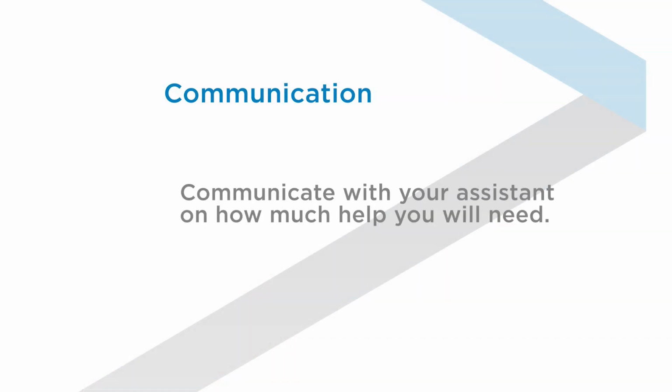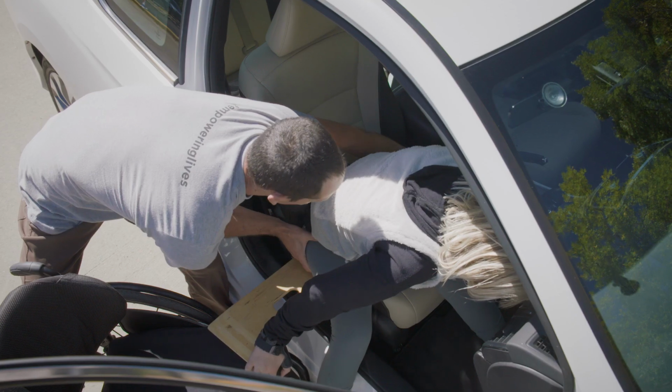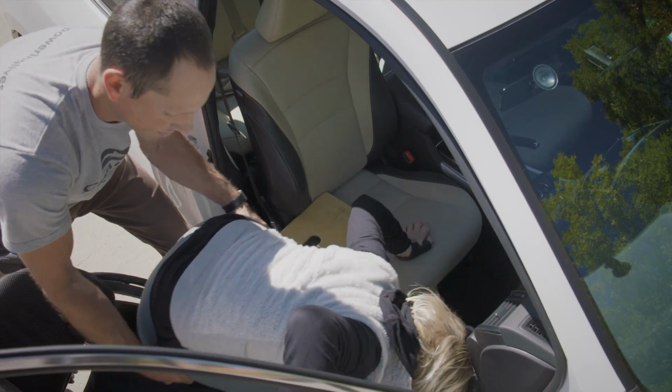Communicate with your assistant about how much help you will need. The assistant will help guide the passenger's hips across the slide board. Avoid hitting the wheelchair tire and car frame as you make this transfer.